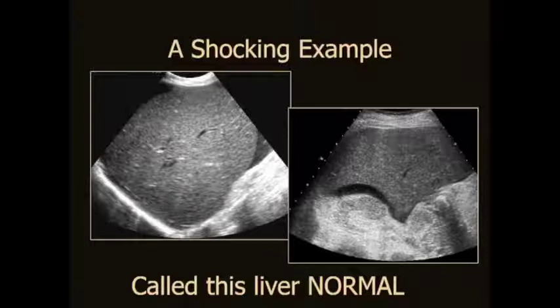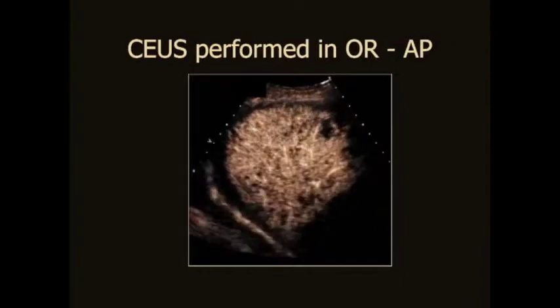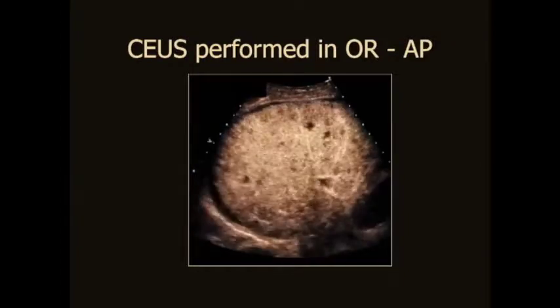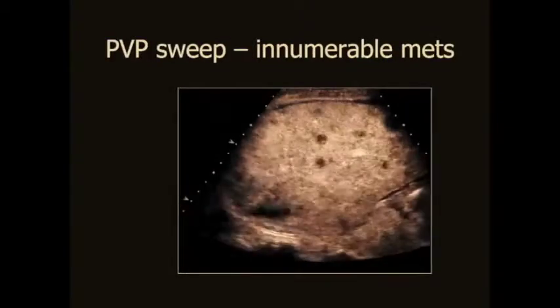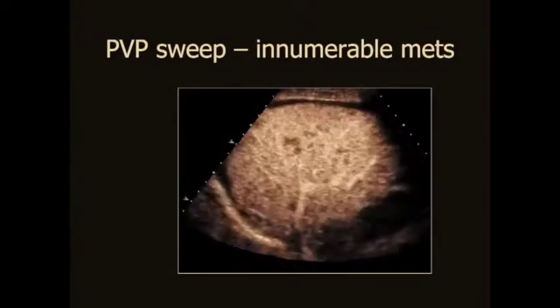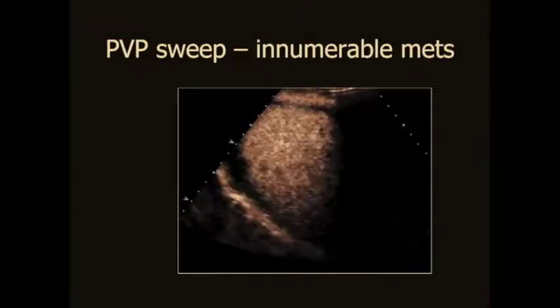So we trundled off to the operating room, and there's the injection of contrast, and you can see that this liver has got multiple lesions in the liver, and when we sweep in the portal venous phase, you can see the tremendously increased conspicuity. So I showed that for effect. Thank heavens this does not happen daily, weekly, or even monthly, but it can happen.